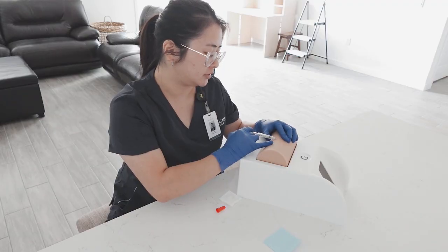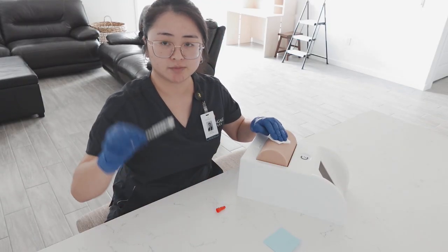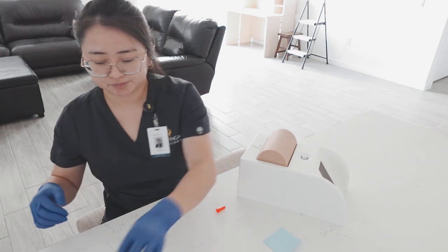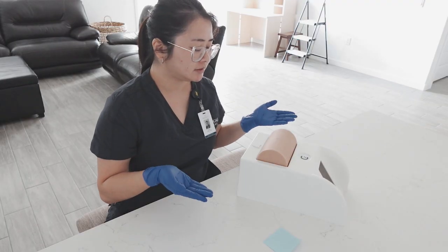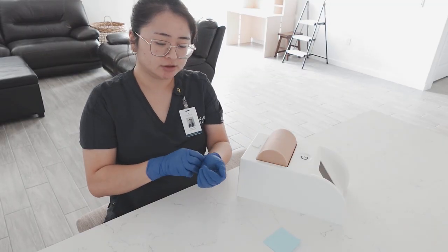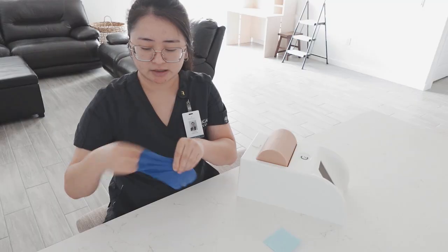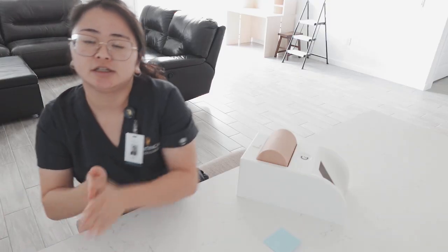So now we are going to grab gauze, gently put it over, take out the syringe. We're going to put this in the sharps container. I'm going to see if there's any bleeding. There's no bleeding, so there's no need for a band-aid. I'm just going to throw that away, throw this away. I'm going to make sure that my patient is in a comfortable position. He's in a comfortable position, as he's told me. And now I'm going to take off my gloves, dispose of that. And then I'm going to perform hand hygiene and document the procedure.